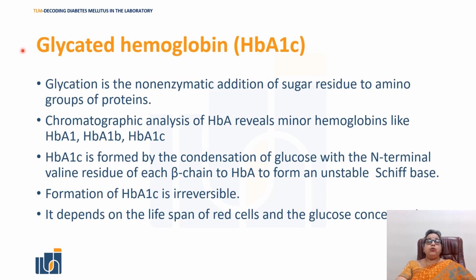Let's move on to another very commonly used test, which today is the one used to diagnose diabetes mellitus: glycated hemoglobin, or HbA1c. So what is this test? Glycation is the non-enzymatic addition of a sugar residue to the amino group of proteins.